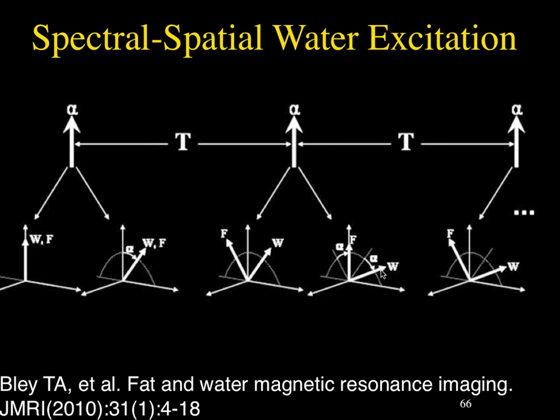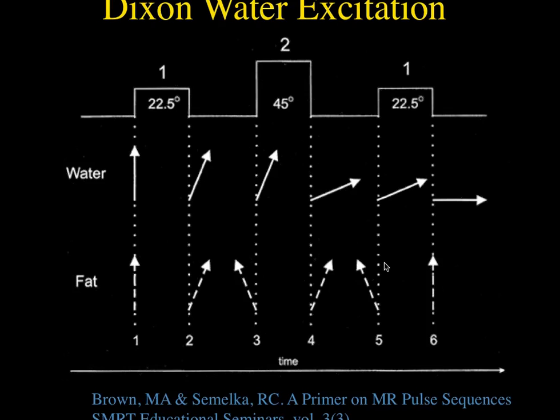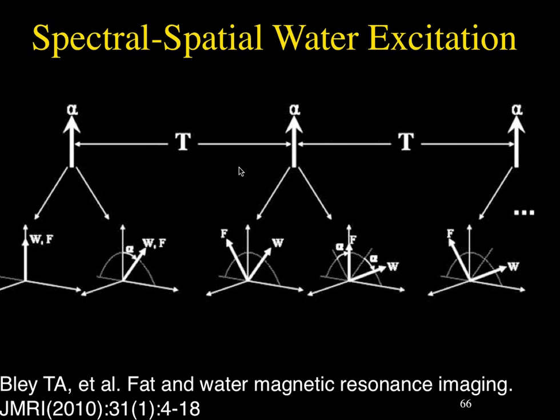Again, this uses the difference in the Larmor frequency between the two structures, and you obviously have to time it just right in order to do that. Another technique. Is that not STIR? That's not a STIR sequence? No, in a STIR sequence, you start with a 180-degree pulse to invert it, and then you do a standard spin echo image with a 90 and 180-degree pulse.